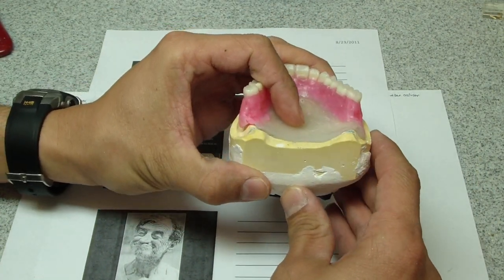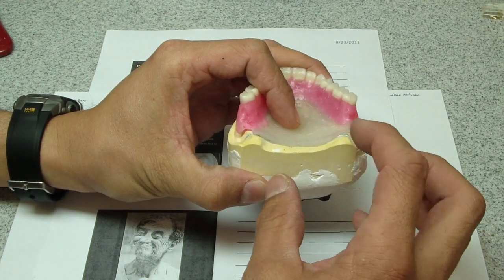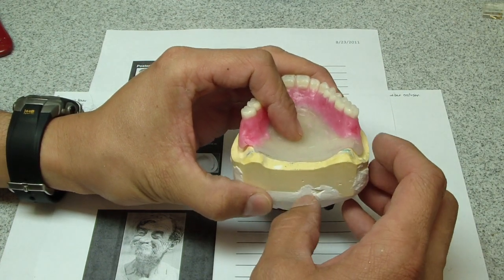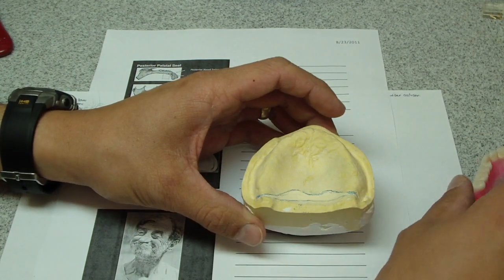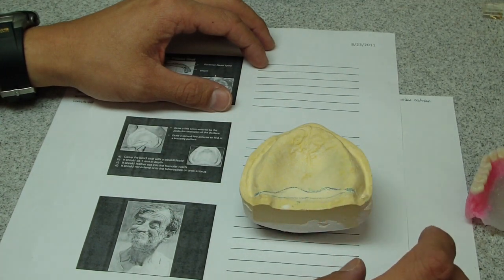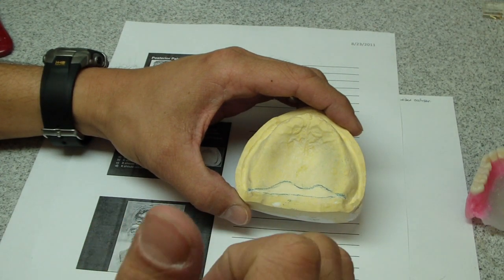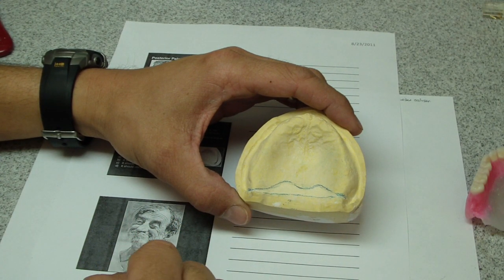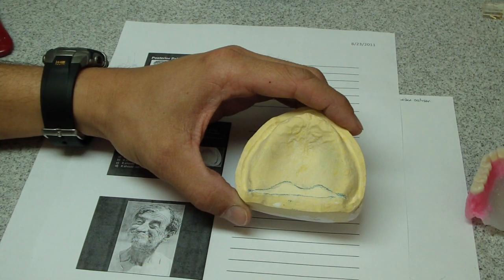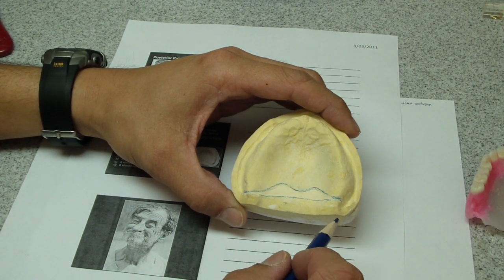You can see, this is my denture base here, even after I adapted it to the model, it shrunk. So we want as much retention as possible. So we use the posterior palatal seal, and this is a really neat design that I wasn't taught when I went to school. I'm not even sure if they teach it, or if this is common, so I figured I'd show what we're taught because it's a little different than I was taught.